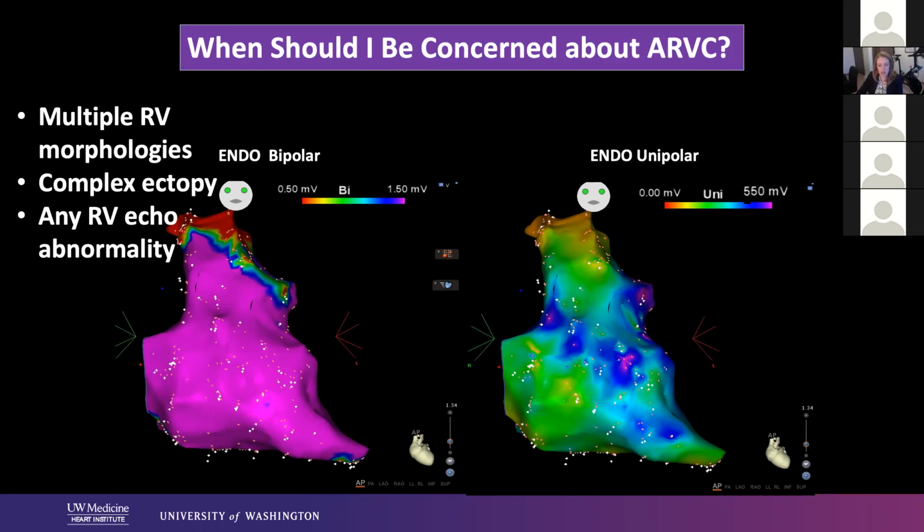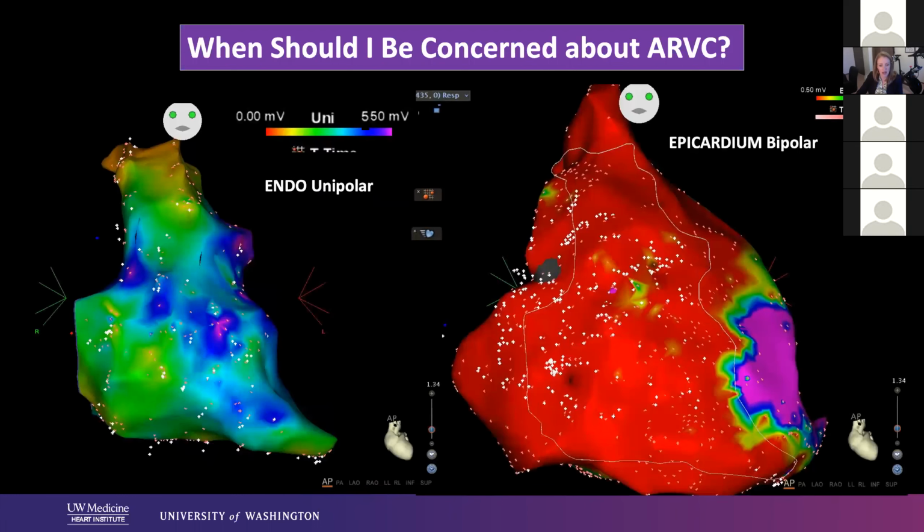And this patient ended up developing VT. This is why it's beneficial to be at the same center for a while. You get these kinds of longer term stories. This was a patient of Jeannie's, and when I looked back at her endocardial voltage from that original procedure, it really did foreshadow this epicardial abnormality.